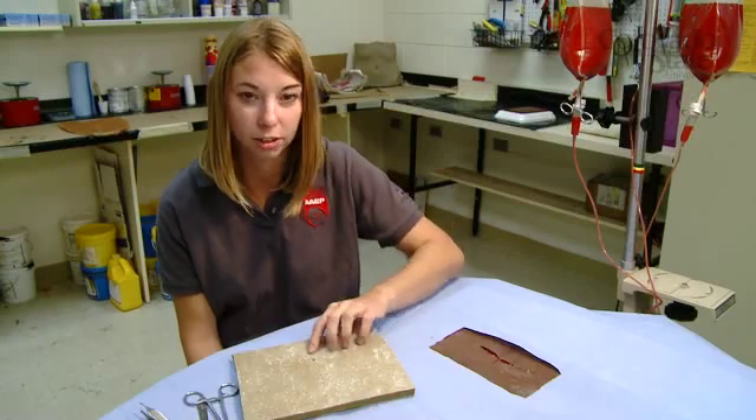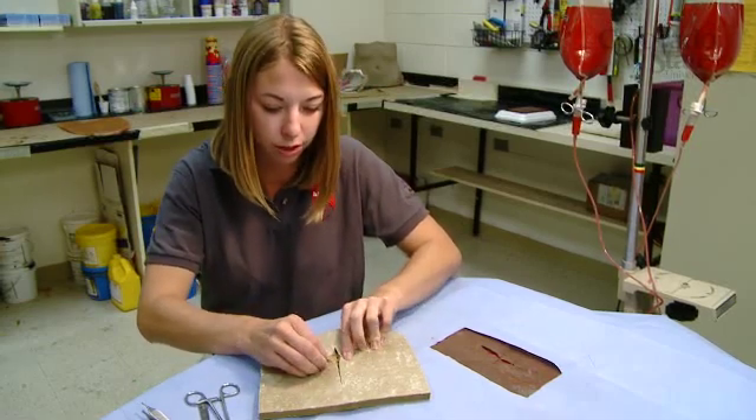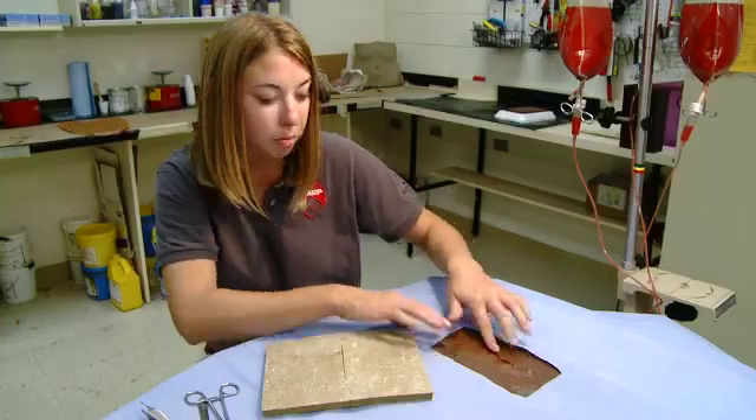I think it's amazing — this simulation feels like the real thing. I remember as a second-year vet student using carpet pads, and your sutures just rip out and they don't stay very well. There's no tissue layers. I'm amazed by the tissue layers on this: the skin, the subcutaneous tissue, even the muscle.